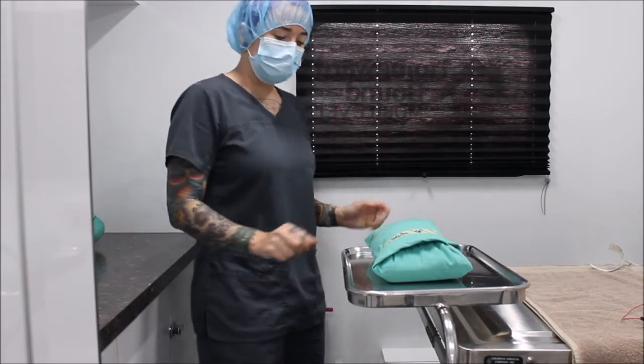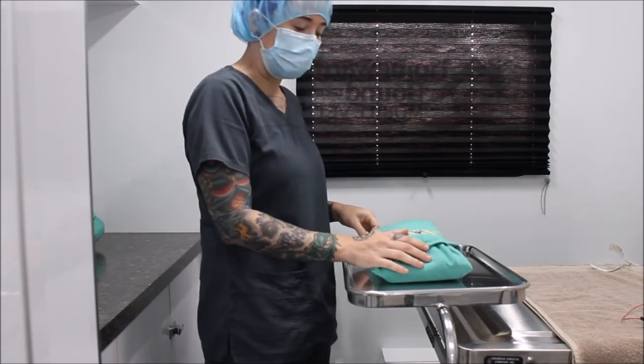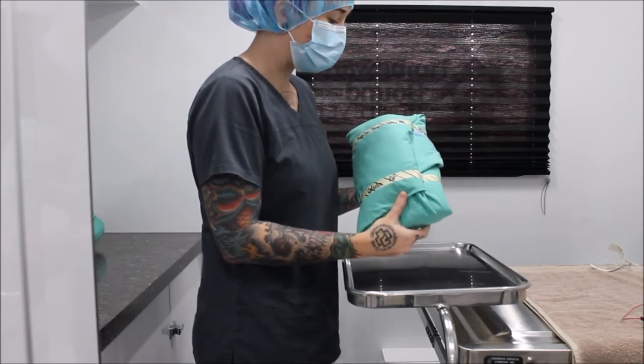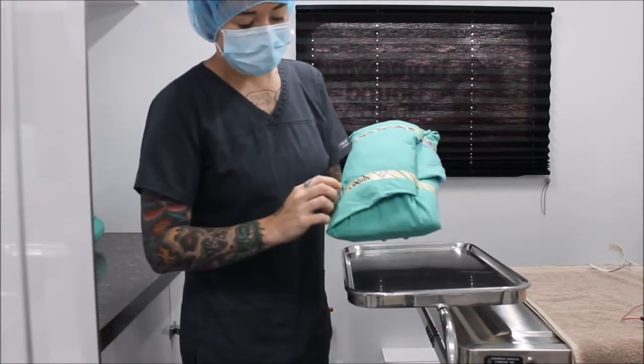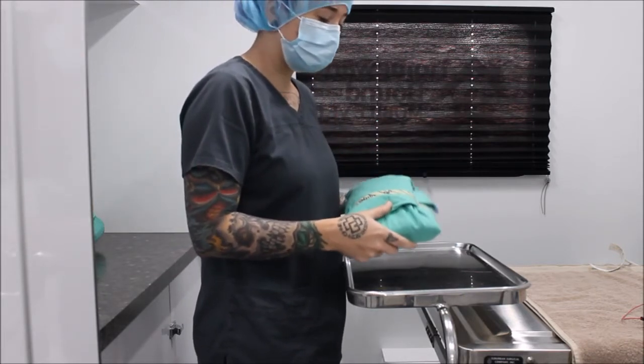Now I'm going to select the proper pack. Today we're going to be performing an ovariohysterectomy on a cat, so I have selected a major small spay pack. As you can see, the tape on the pack has turned black, which indicates it has been exposed to appropriate steam.